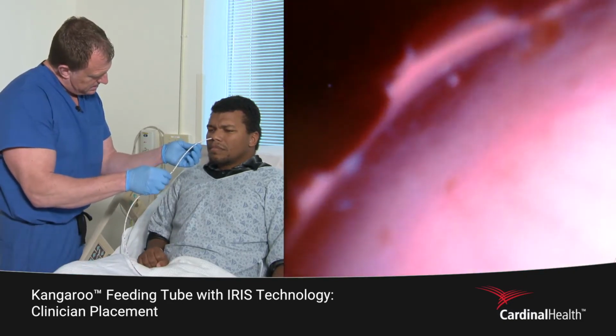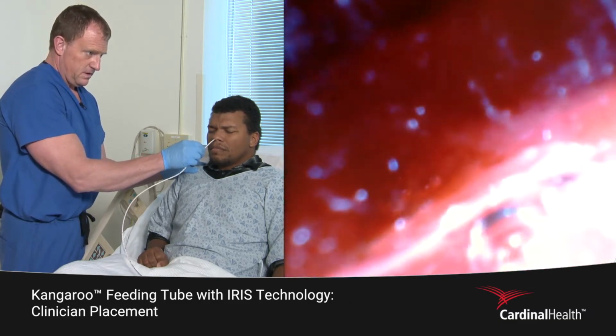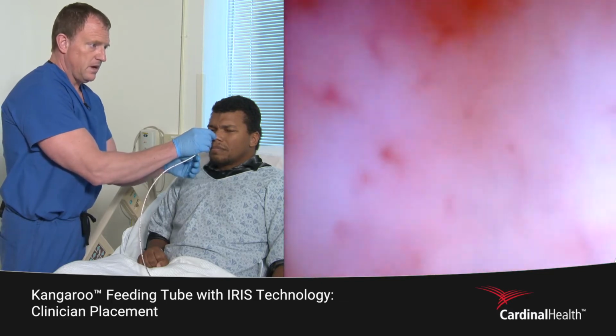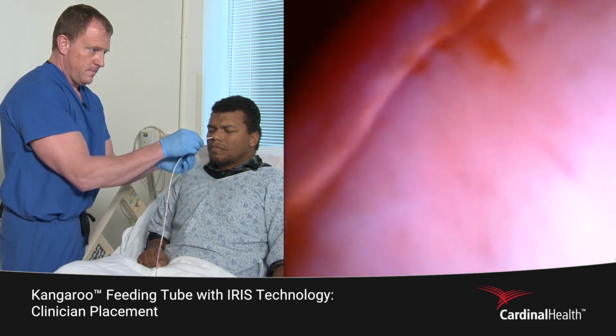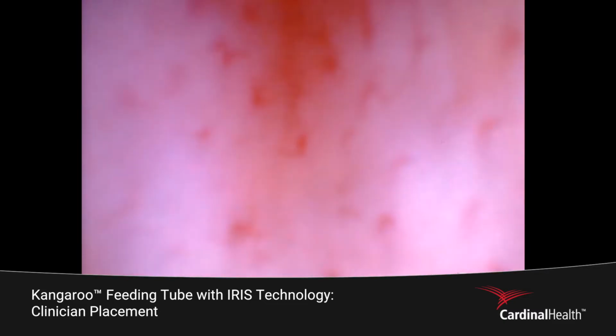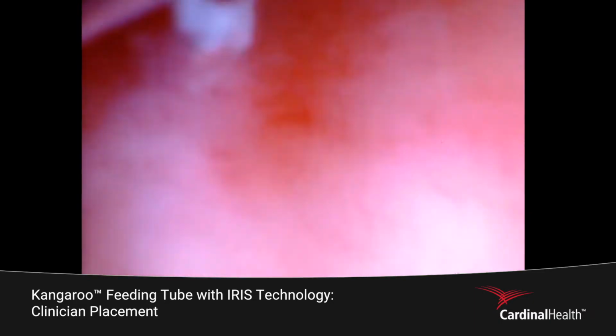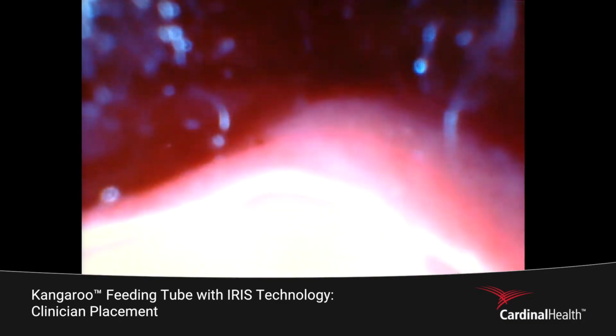So I am at about 60 right now, 60 centimeters. So we're gonna walk real slow from here in, right along the curve of your stomach. Going real slow. Rotate the tube a little bit to make it go where I want it to go.